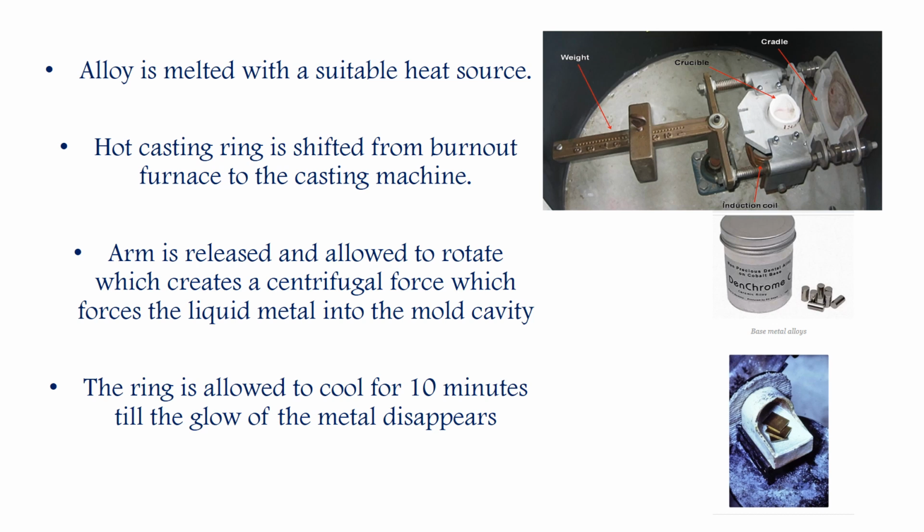When your metal is hot, when it is ready to be injected, it will look like mercury. You have seen liquid mercury, it glows. So it will have that glow. After 10 minutes, when it cools down, the glow will disappear.